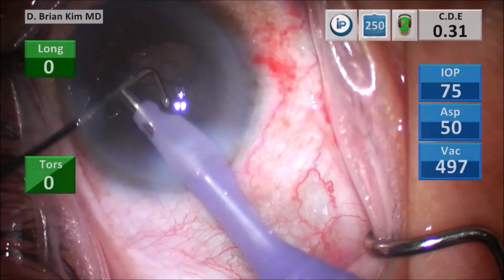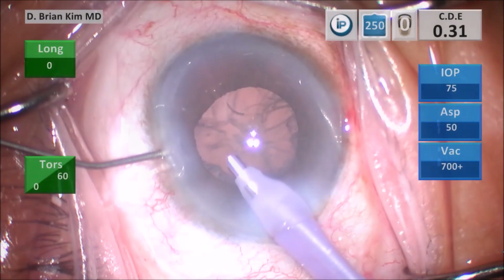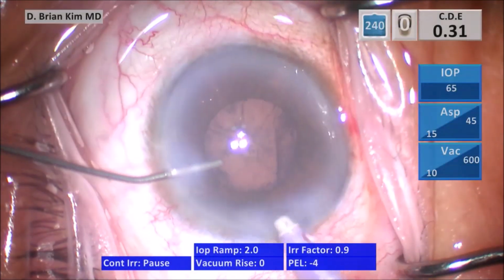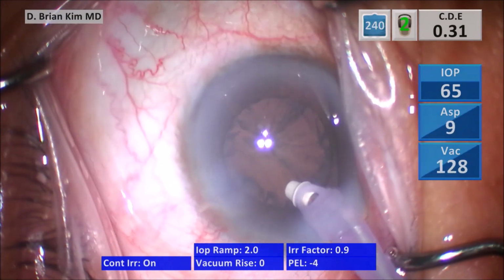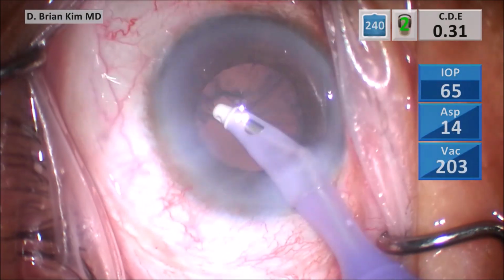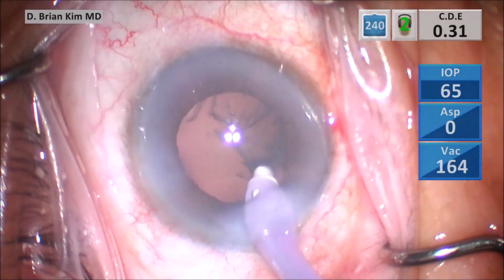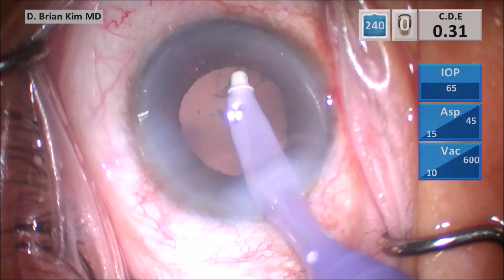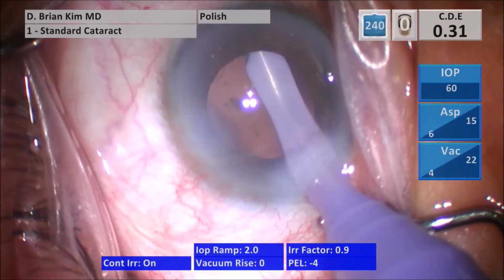After I'm done with the chop maneuver, I push BSS through the paracentesis. I pull out the phaco tip, switch to the I/A in order to maintain chamber stability, and then I begin my I/A. I start subincisionally, removing all the cortical material, and I switch to a polish mode in order to remove any lens epithelial cells and also to polish underneath the anterior capsule as well as on the posterior capsule.